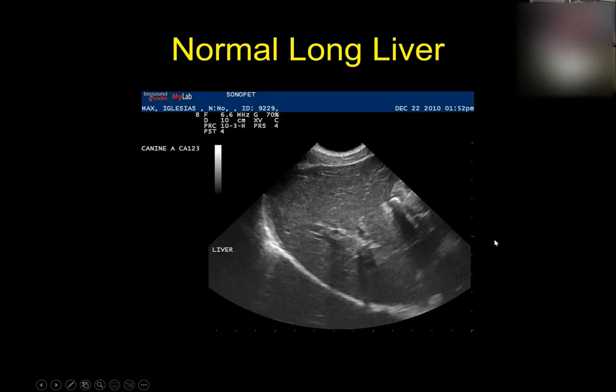Okay, because most of the time, especially when you are ultrasounding a dog and you're learning, the easiest position to have a dog in is lying on their back. Some people teach ultrasound with the dogs lying lateral, but it's much harder to learn, and I don't recommend it. I would highly recommend, when you're learning ultrasound, and for the most part when you're doing ultrasounds, put the dog on their back and scan them when they're lying on their back.